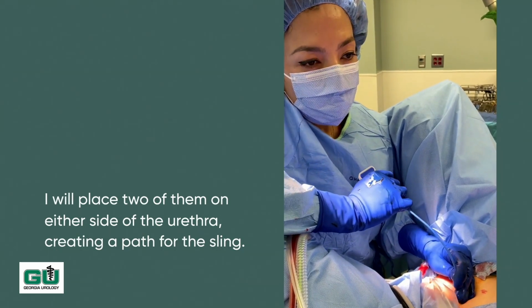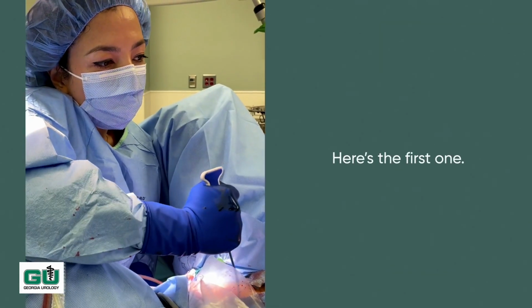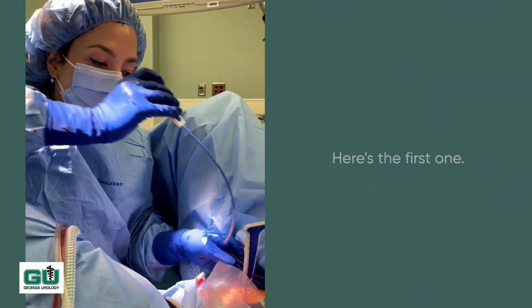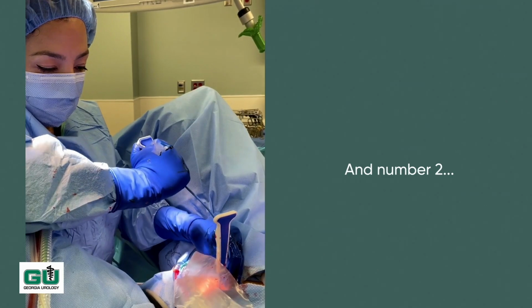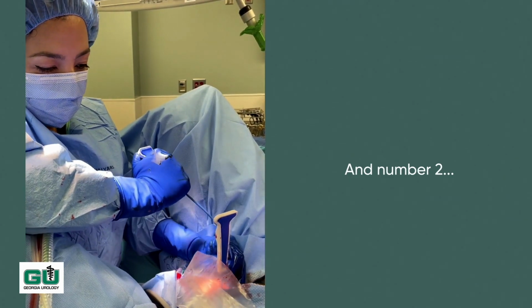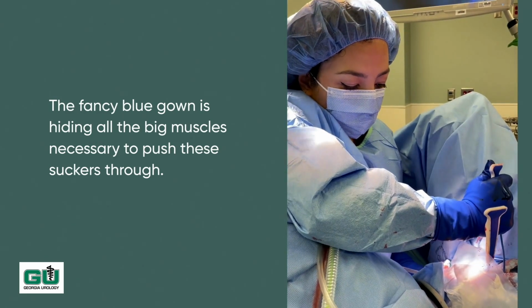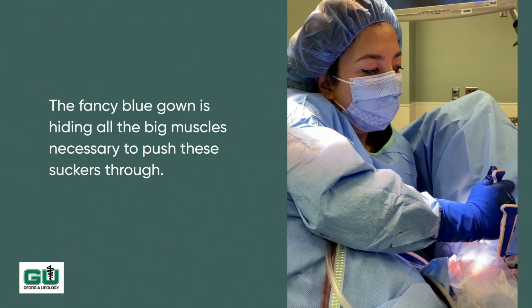And then I use those curved knitting needles and go through the patient's skin and through muscles until the end of that curved knitting needle has come out through the vaginal incision that I made. And these knitting needles rest on either side of the patient's urethra.